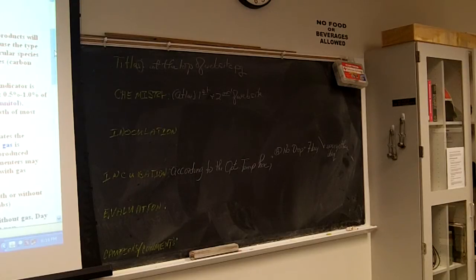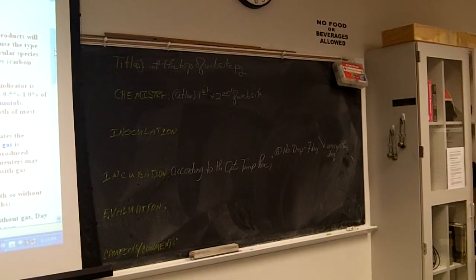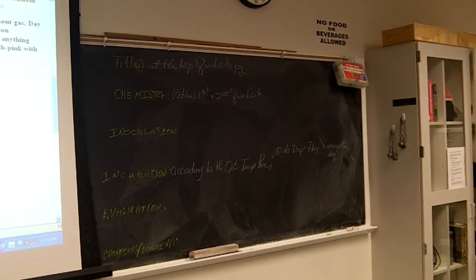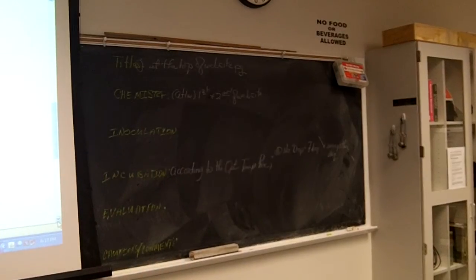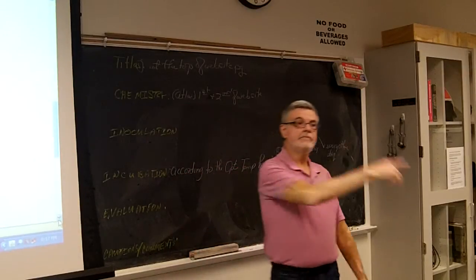So if you see yellow, on Thursday, you pull it out of the incubator, you mix it, because remember, they settle, and if it's positive, you write down fast positive, because it's the first time you've read it in 7 days. This is a nice book, and this is the way it really looks in the real world. Okay? So that's not hard, is it?